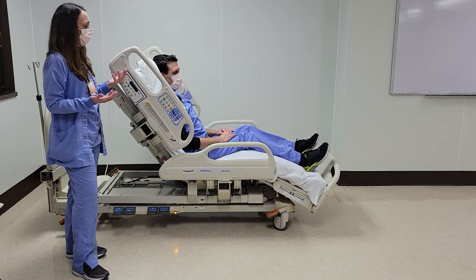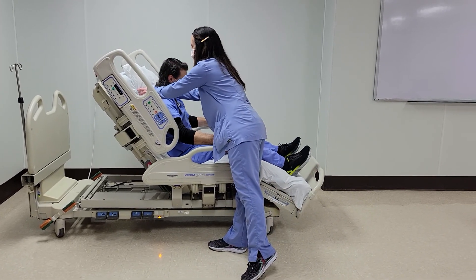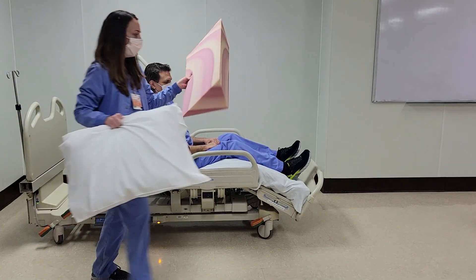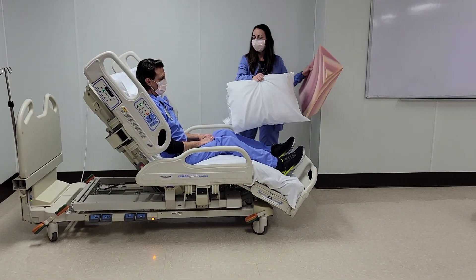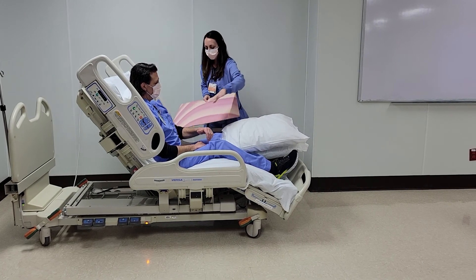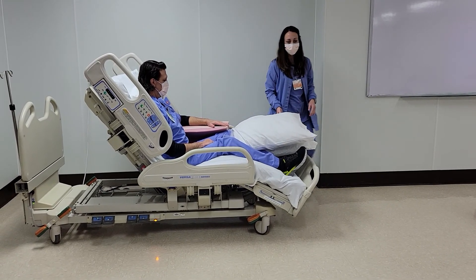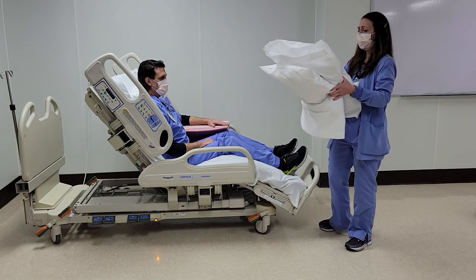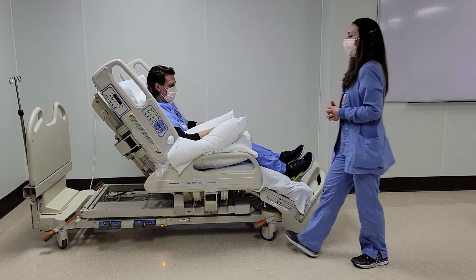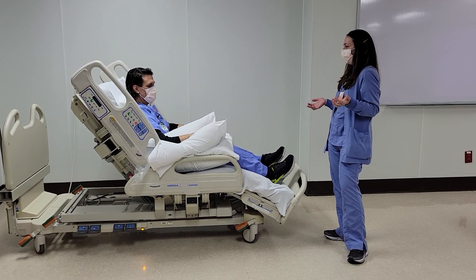A couple things in this position for patient comfort: with the patient in the chair position, have them lean forward and tuck a pillow behind them. Arm positioning is important — we like to use the wedge, or whatever's available. This is important for patients with swollen extremities or weakness. Position it with the flat part on top underneath the patient's arms — it gives them weight bearing, a sense of security, and better hand positioning. Do the same thing with pillows if that's all you have. Tuck them on the other side. The patient feels more secure and it's better positioning — good for eating, weight bearing, and arm integrity. That's the cardiac chair position.